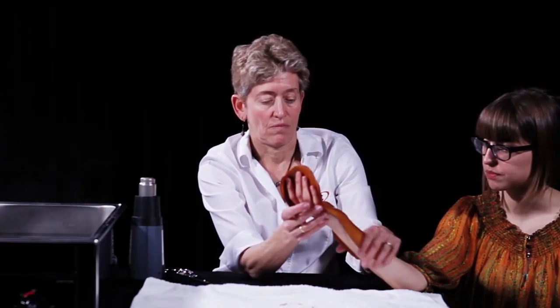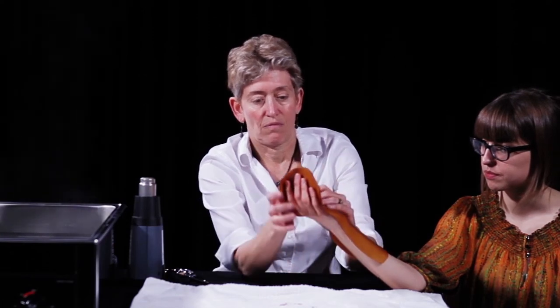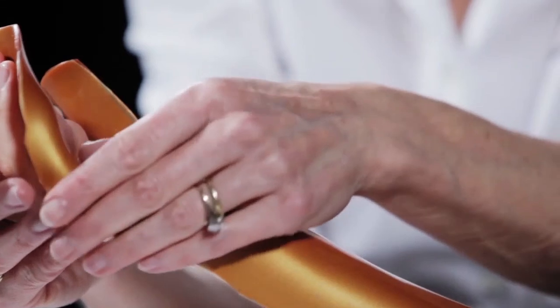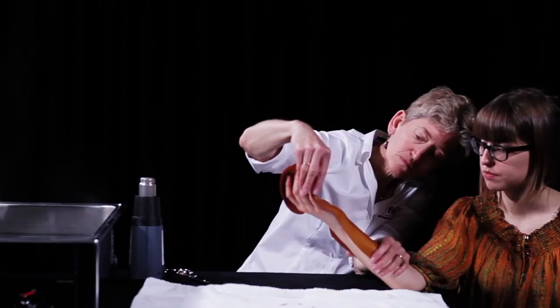Stretch the material onto the first web space so that it conforms and offers support to the thumb and index finger. Smooth the material down the forearm, stretching it slightly to help it conform.